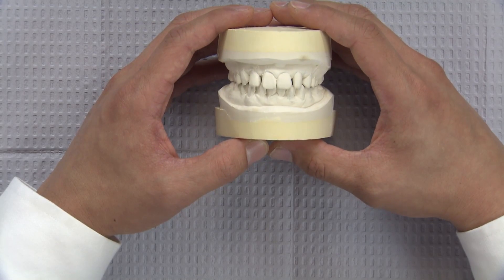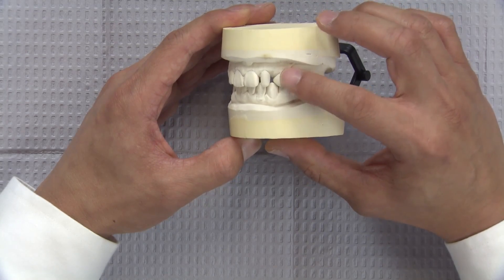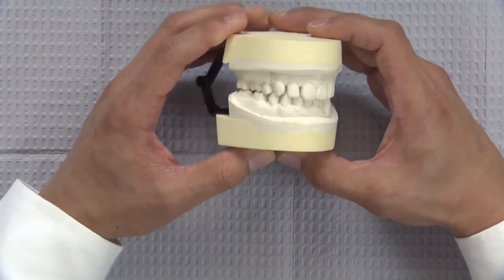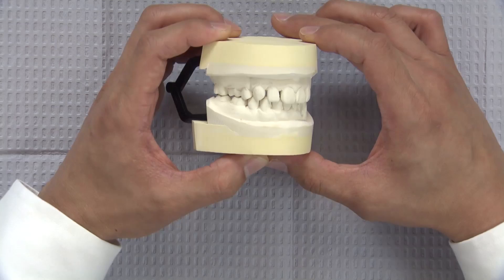In this case, we have a 22-year-old female that presents with peg laterals and also a congenitally missing maxillary left canine, tooth number 11. The patient would like to enhance the aesthetics of her smile by closing the diastemas on either side of the laterals.